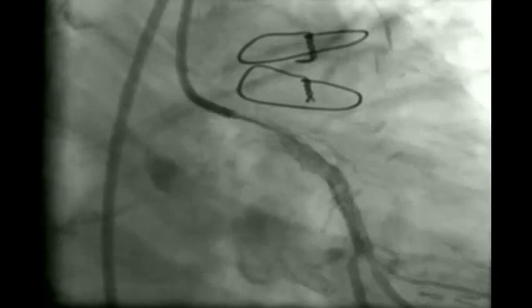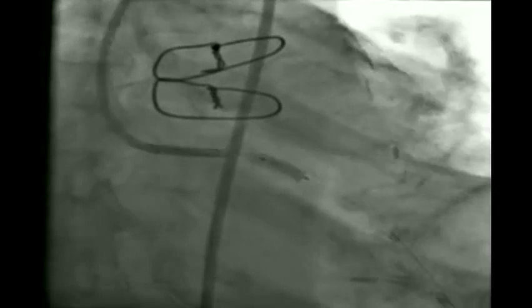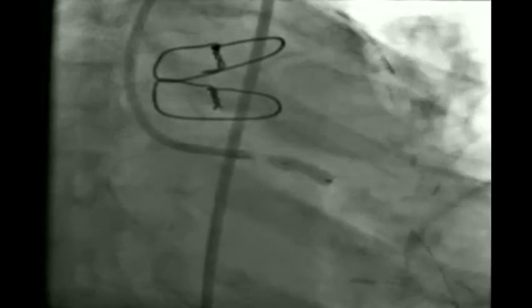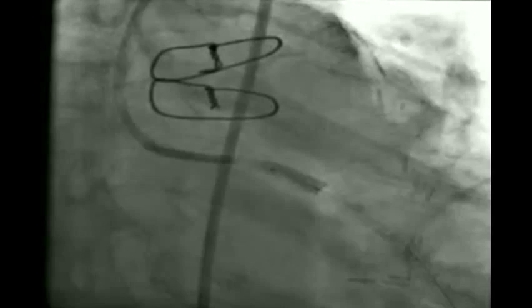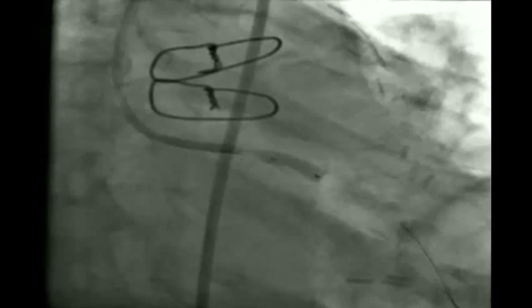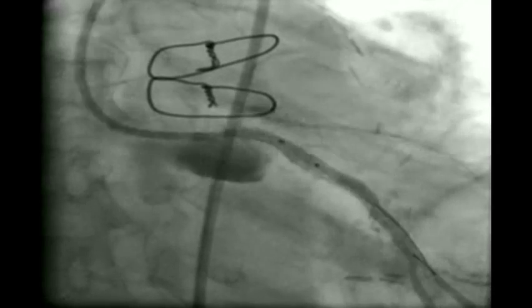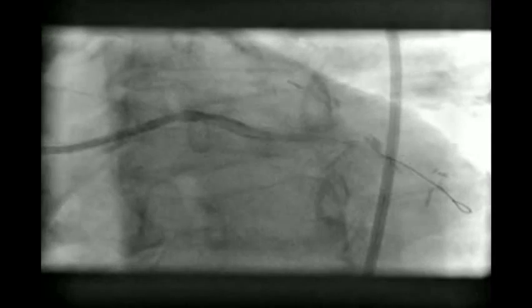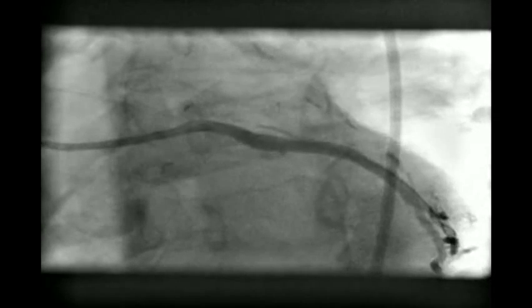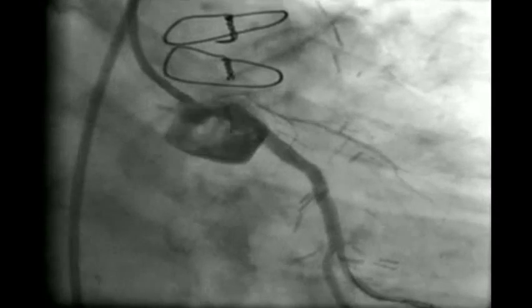As mentioned, you cannot oversize the balloon — if you used a 3.5 mm stent, do not use a 4.0 mm balloon for post-dilation. Instead, use the same 3.5 mm non-compliant short balloon within the stent and go up to 24 atm to overcome recoil. The overlap segment is also post-dilated. Final angiograms show good, acceptable results with no thrombus, no plaque prolapse, and no dissection proximally or distally.